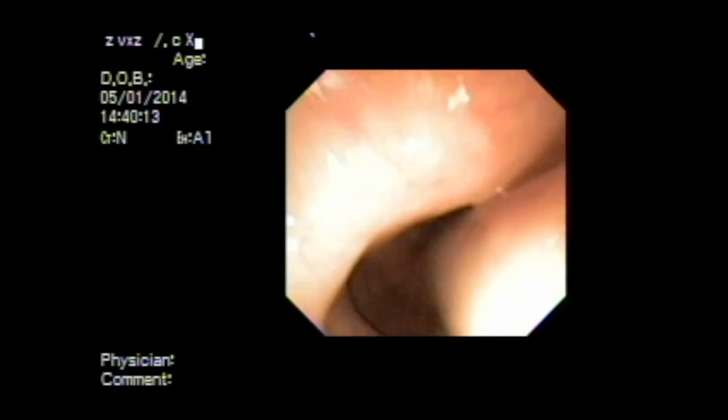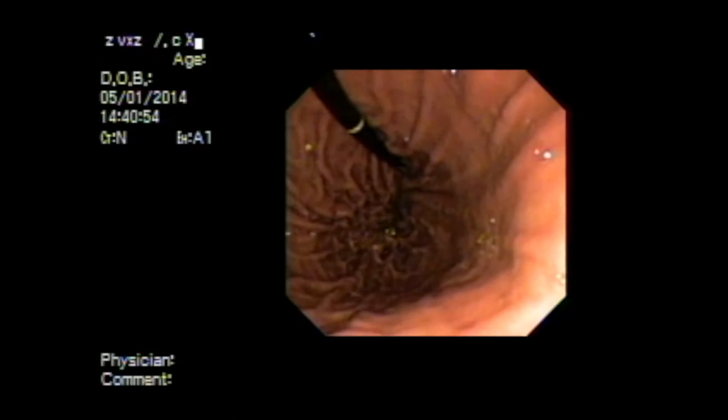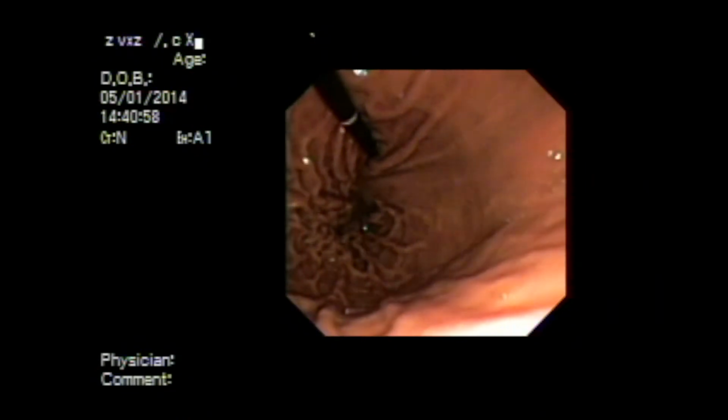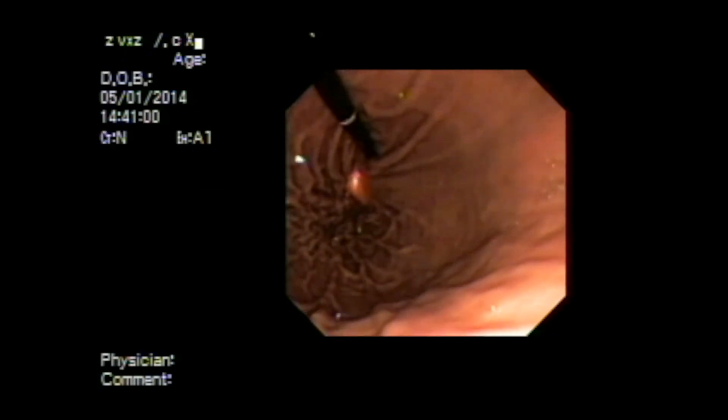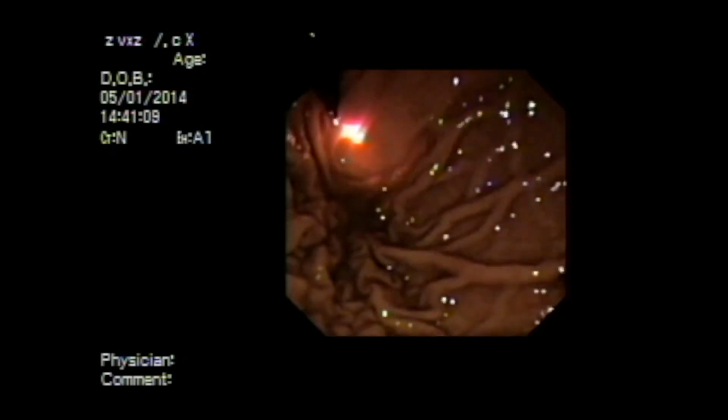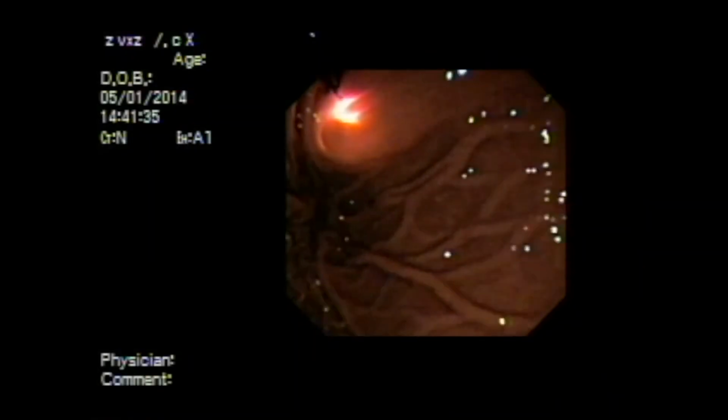The pediatric scope was withdrawn, and further tunnel dissection was undertaken. On repeat intraluminal retroflexion, the end of the dissecting scope is now observed within the gastric lumen. The pediatric endoscope light is dimmed and the dissecting scope light brightened. The tip of the dissecting scope is now easily identified, and the extent of the dissection is confirmed.